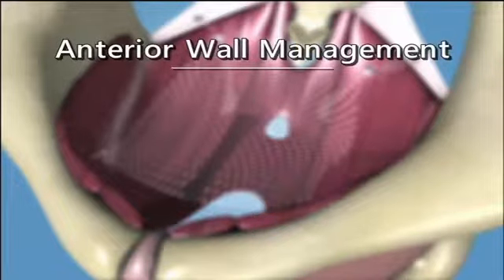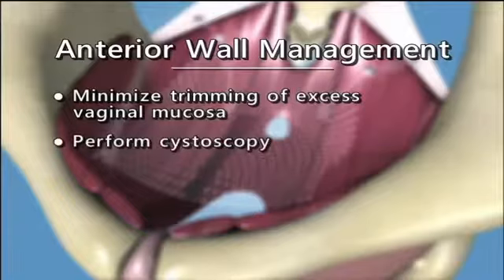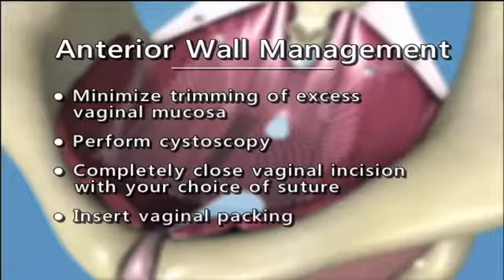Anterior wall management. Minimize trimming of excess vaginal mucosa. Perform cystoscopy. Completely close vaginal incision with your choice of suture. Insert vaginal packing.